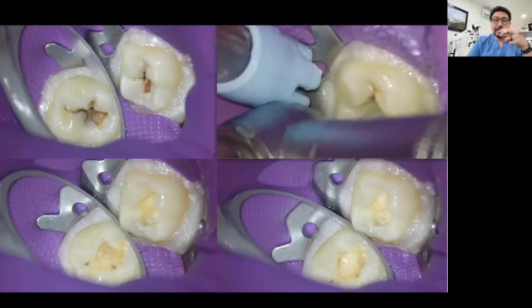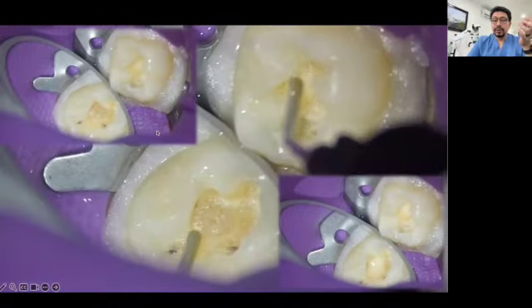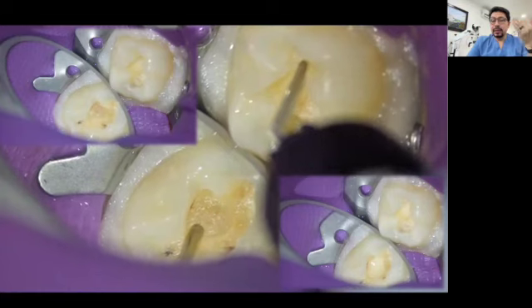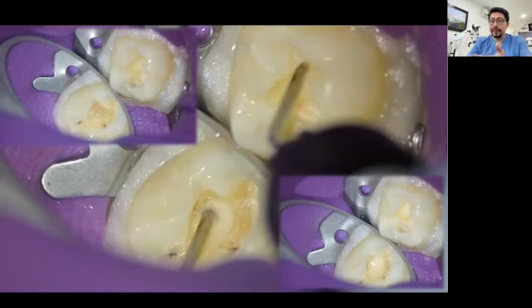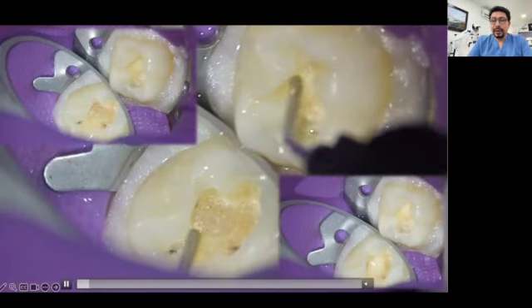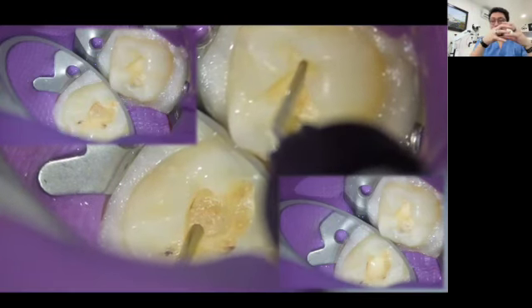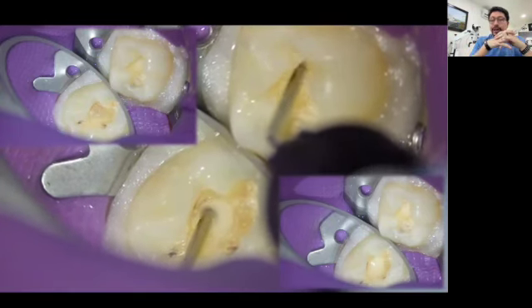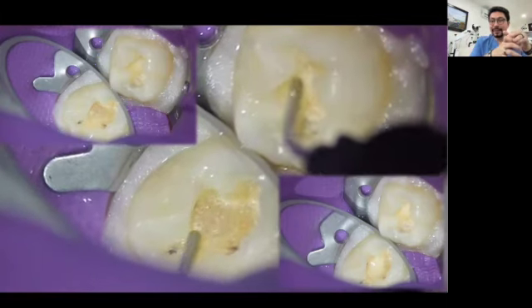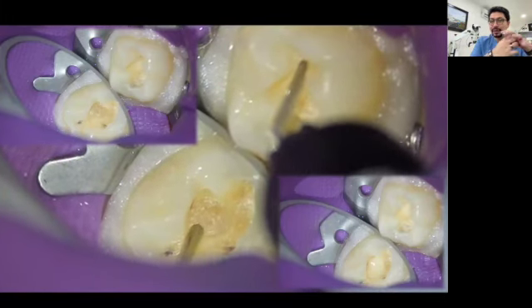Is it only a change of color, for example? And we will have the chance to be more conservative with our treatments. We can analyze even how deep we are inside of dentin, because remember, guys, that the pulp and the dentin are strictly correlated. That's why you call them the pulpodentinal complex. As soon as you touch the dentin, you are already generating some reactions inside of the pulp.